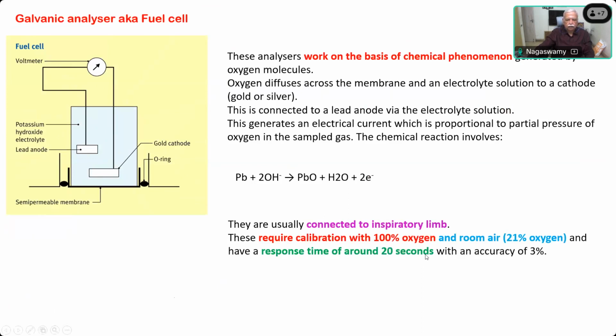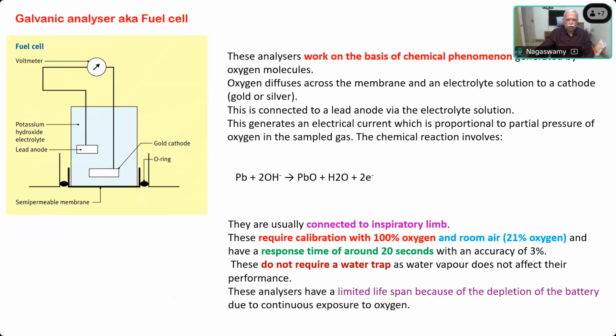But it has a response time of about 20 seconds. The accuracy is about 3%. They do not require a water trap because it is a reaction which is happening inside the cell. It is like a battery. So these analyzers have a limited lifespan because of the depletion of the battery due to continuous exposure to oxygen.